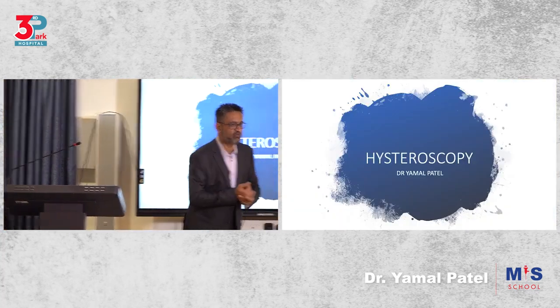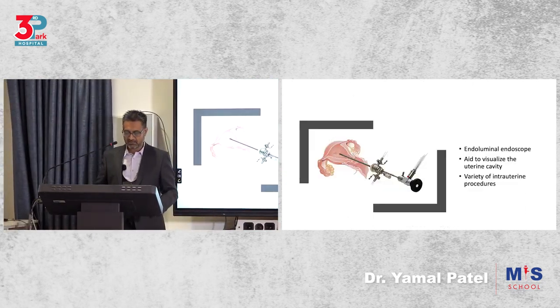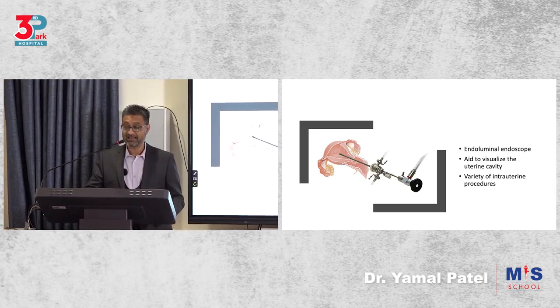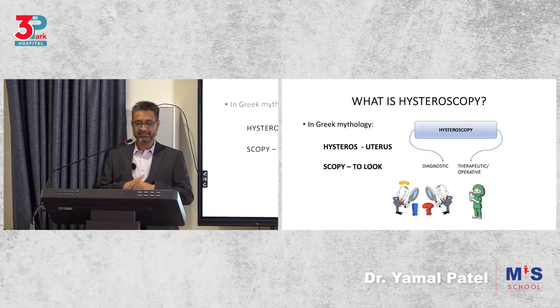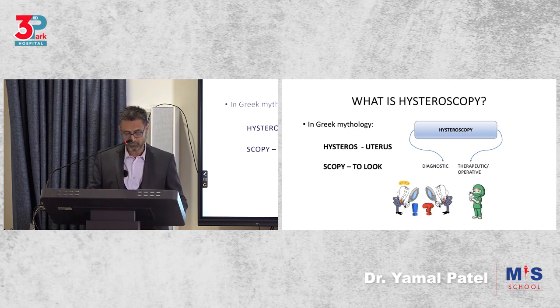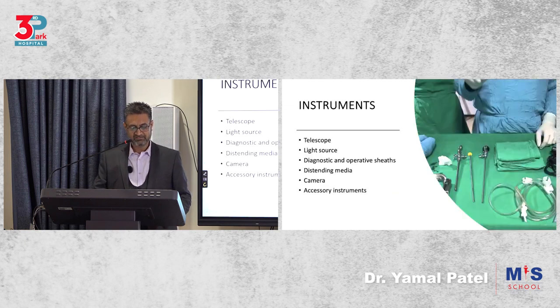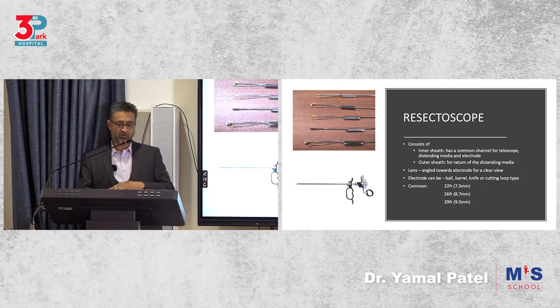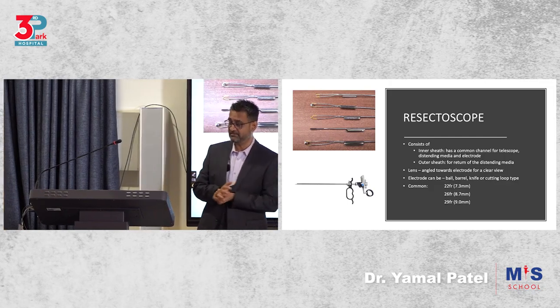Did we discuss hysteroscopy? So I can quickly give you some tips on hysteroscopy. It's an endoluminal endoscope to visualize the uterine cavity and can be used to do a variety of intrauterine procedures. It's from the words hystera and scopy, to look into the uterus, and can be used for diagnostic and therapeutic procedures. The instruments are the following. We've discussed these. Then we have the resectoscope, which is for more operative procedures using energy.